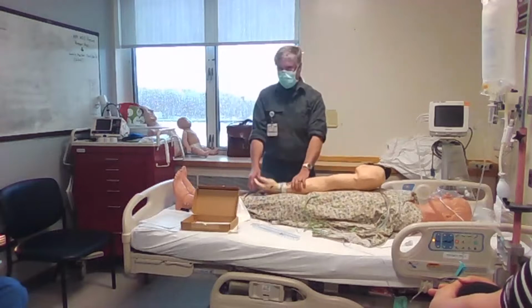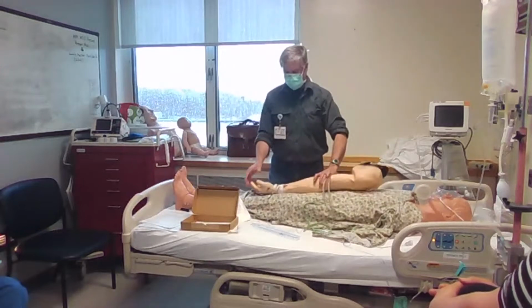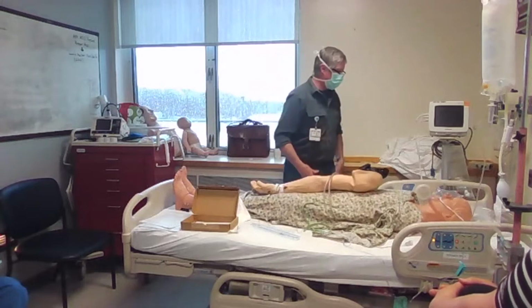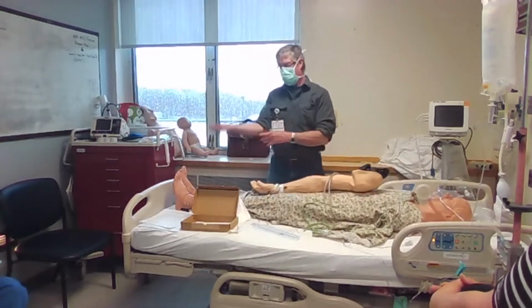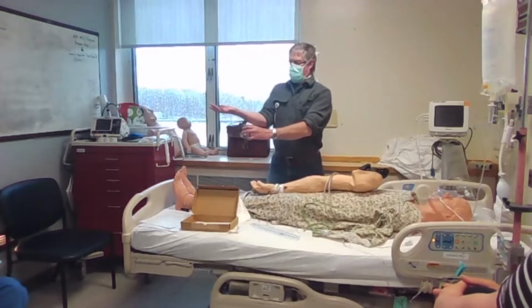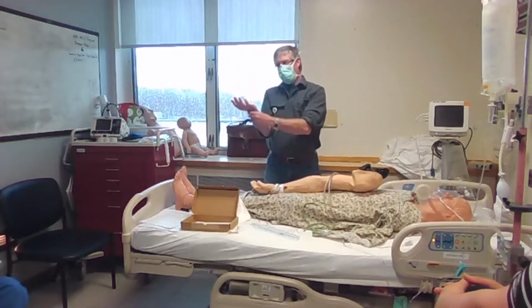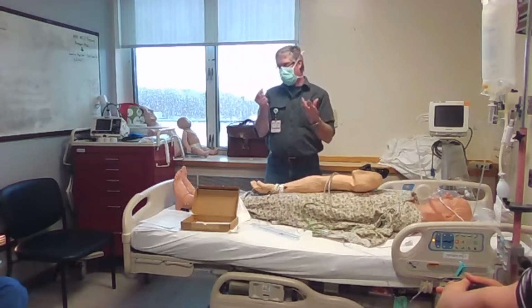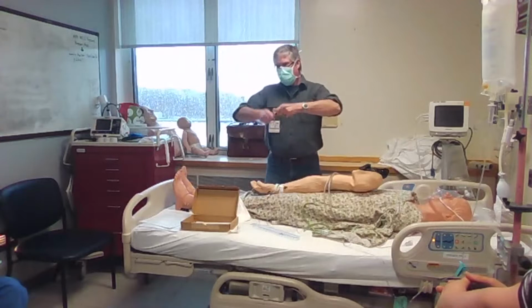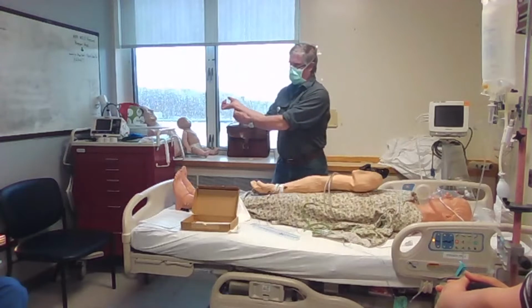It's not typically the easiest to do it on just a flaccid hand that's laying straight. I feel weird with an arm in front of me. So you need to position it. One of the things we do is we tape it down. And what makes it easier is if you put a wrist roll underneath it. What I'm talking about with a roll is a boat of 4x4s, they got maybe 10 in them. You can roll the whole thing up, wrap some tape around it, and you put it right here underneath the back of the wrist.